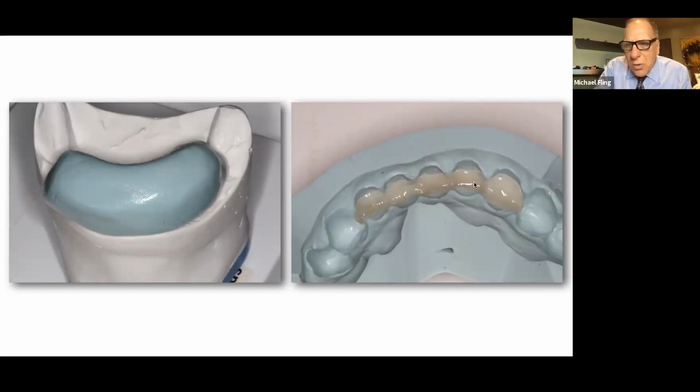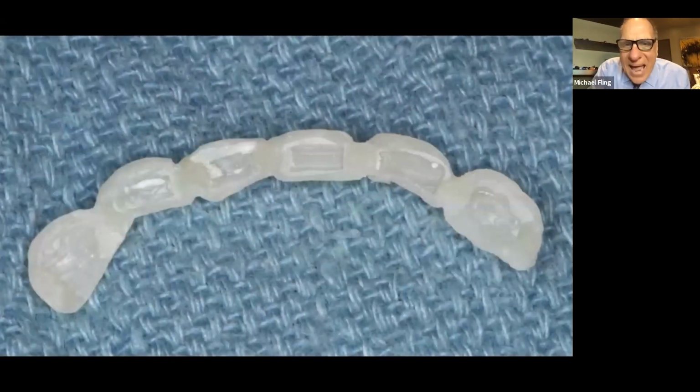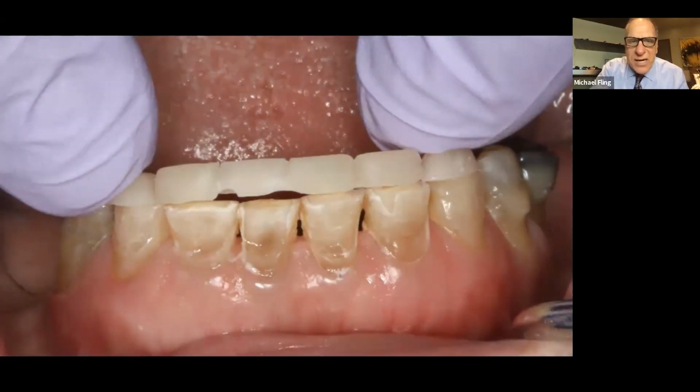But you see, it's just a really thin shell of material here. You've got to get this out without breaking it. That becomes the challenge. So your assistant or somebody's going to help you hold this apart, and you're going to tease this thing out, and then you're going to trim it until what? It passively fits. So you're going to get a diamond burr on high speed, and you're going to come in here and grind these out interior-wise as needed until you can get this to passively fit. And that's what he's doing now. He's trying to get that adjusted where it'll passively fit.